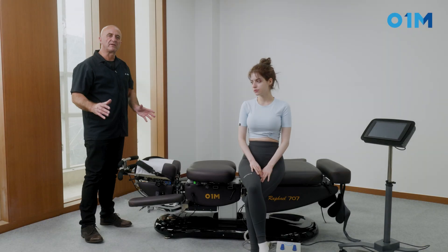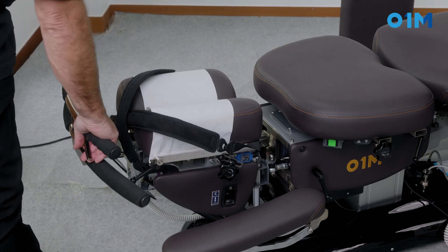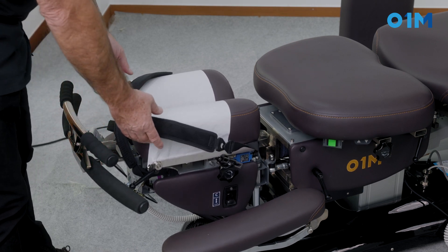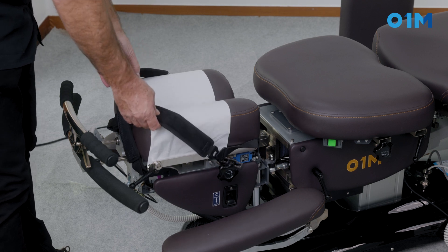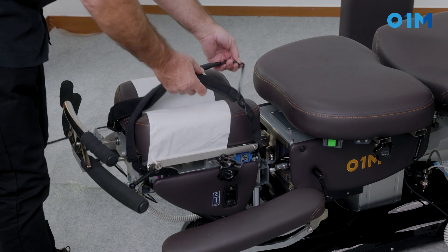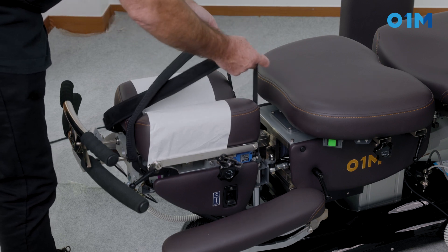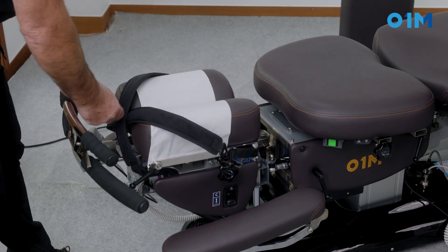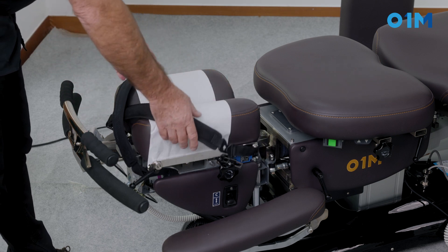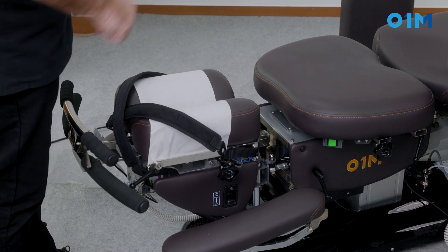We can have a cervical distraction for that patient, and for that we're going to use the function of the cervical headpiece that goes up and down. Now we need to strap the patient's occiput prior to doing that. A little trick: we're going to open up the caudal section where it's elastic — it should be open completely — and the cephalad section toward me should be crossed. We're going to have the patient lay down on her stomach, face down, and cross that over her head.